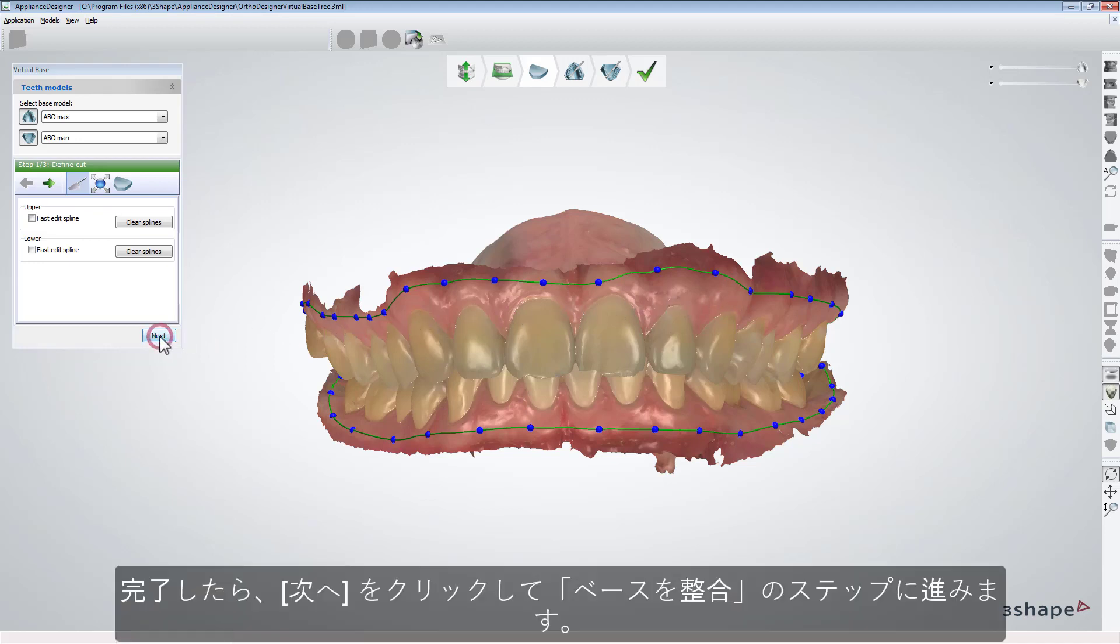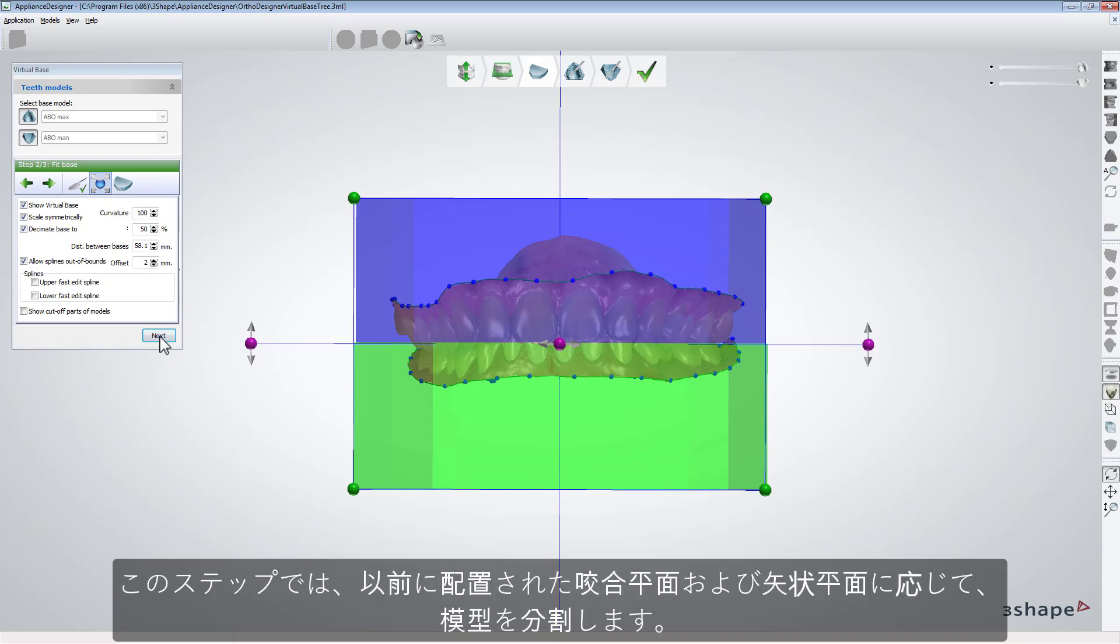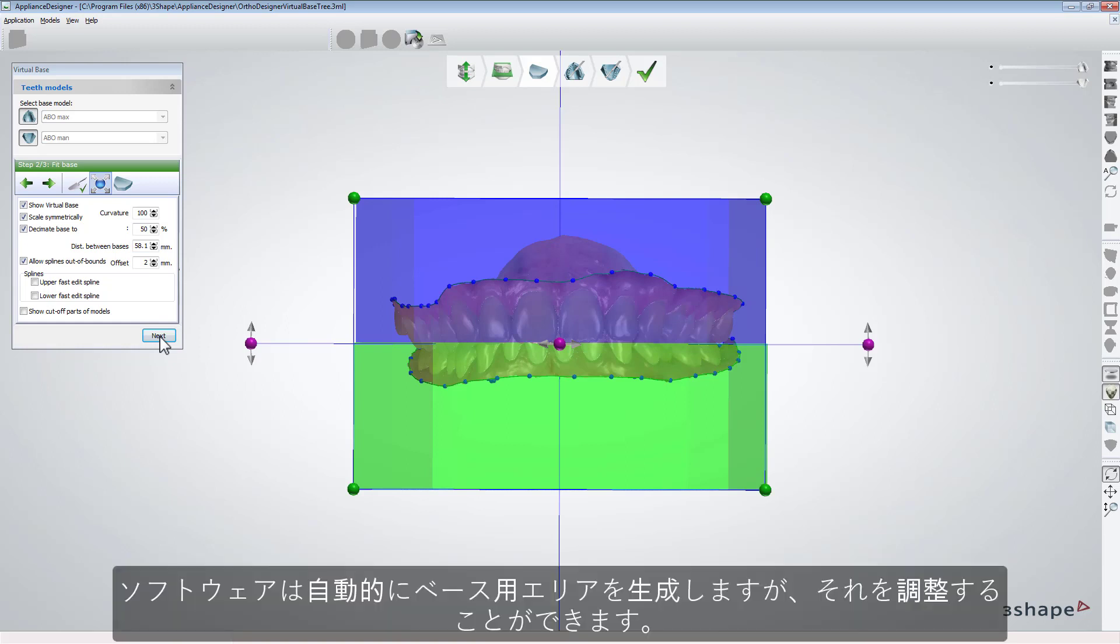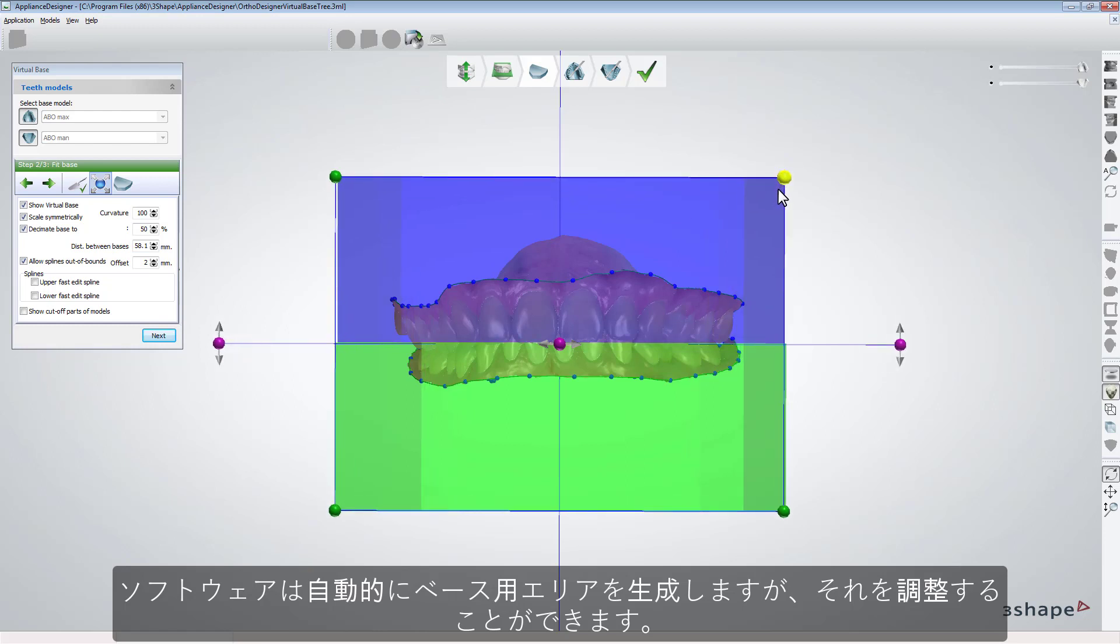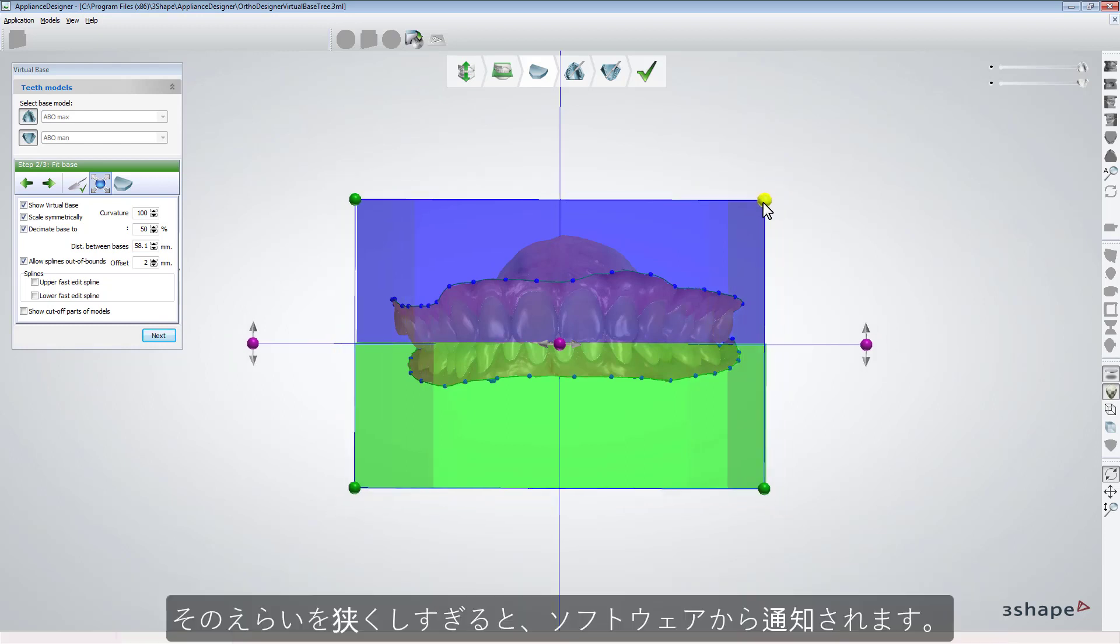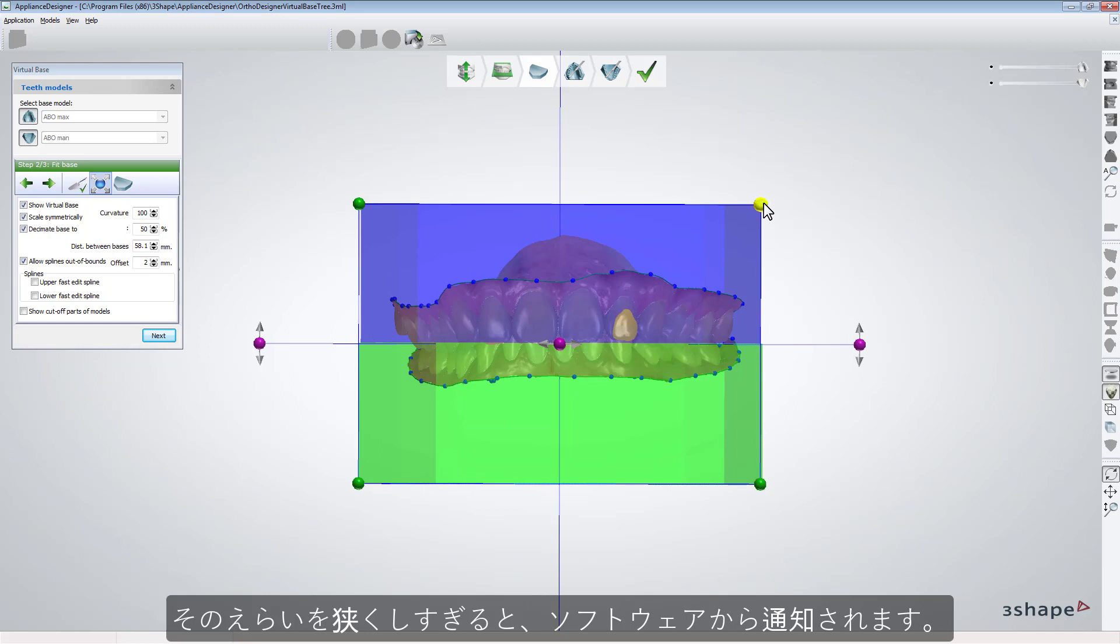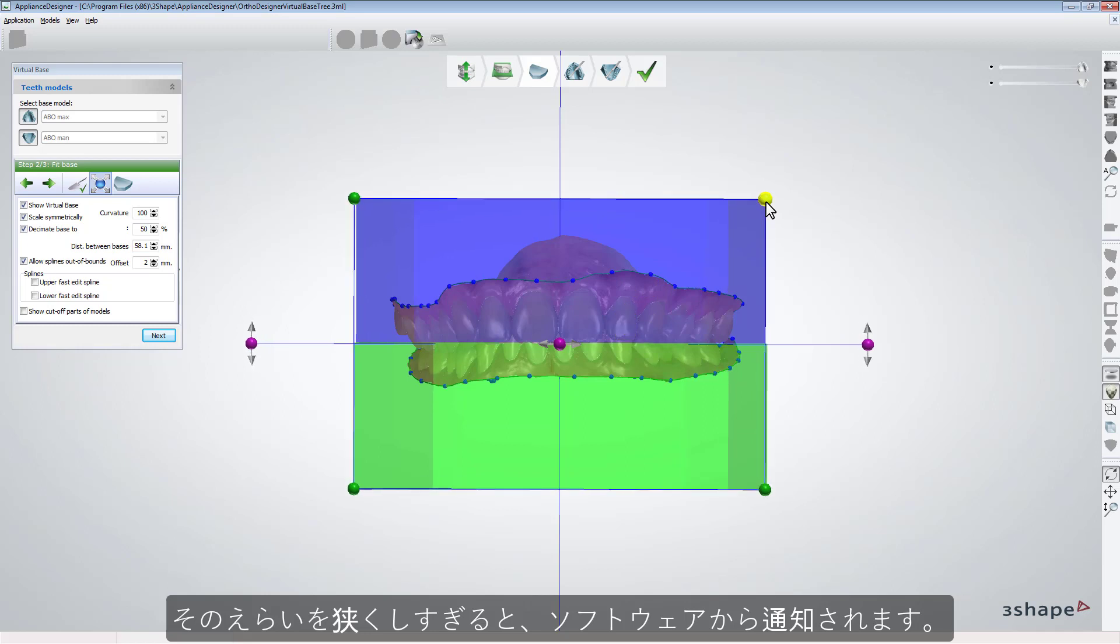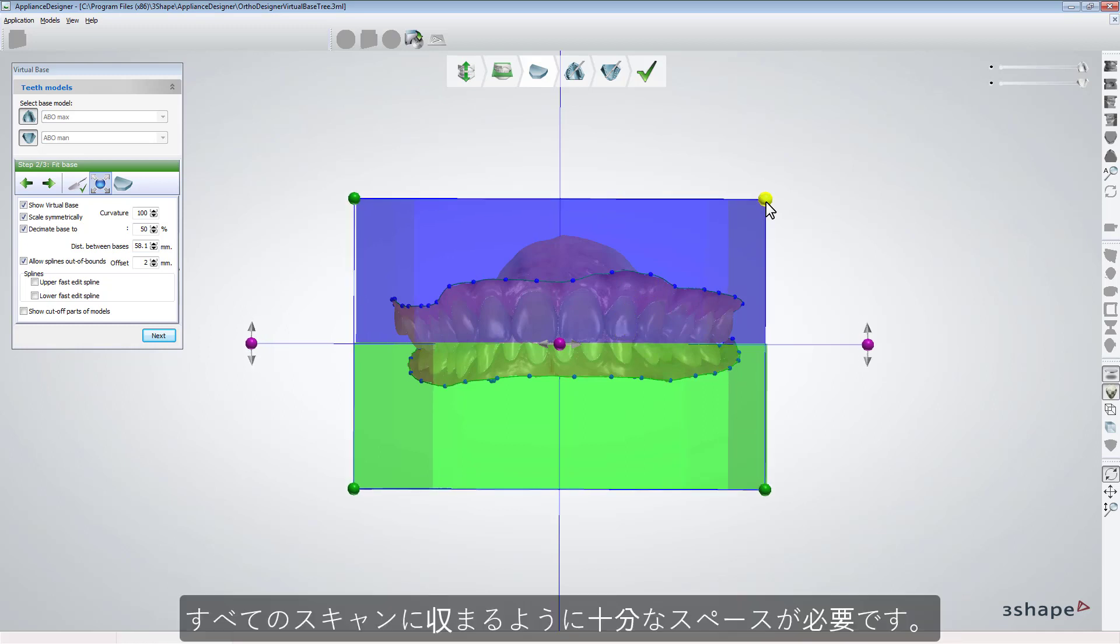When you are done, click Next to get to the Fit Base step where software will divide models according to occlusal and sagittal planes set earlier. The software will automatically generate the area for the base, but you can adjust it. If you make that area too small, the software will inform you.